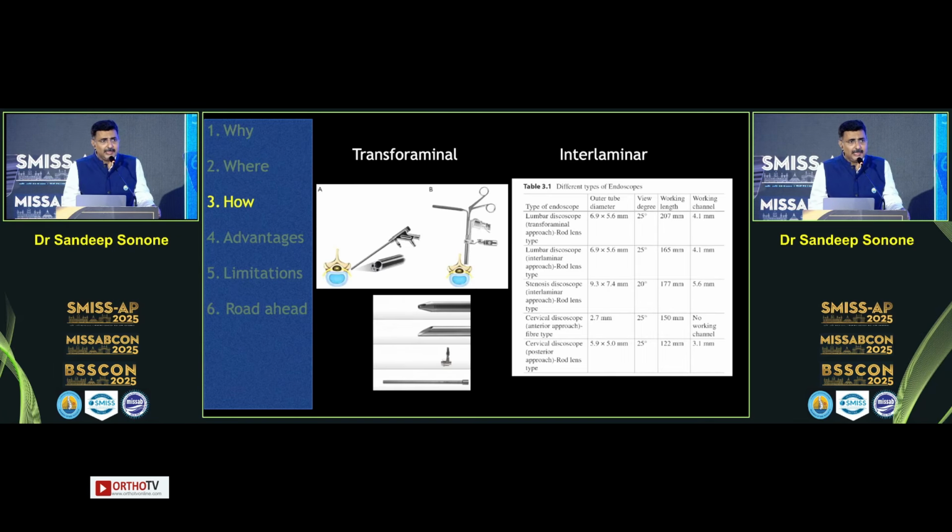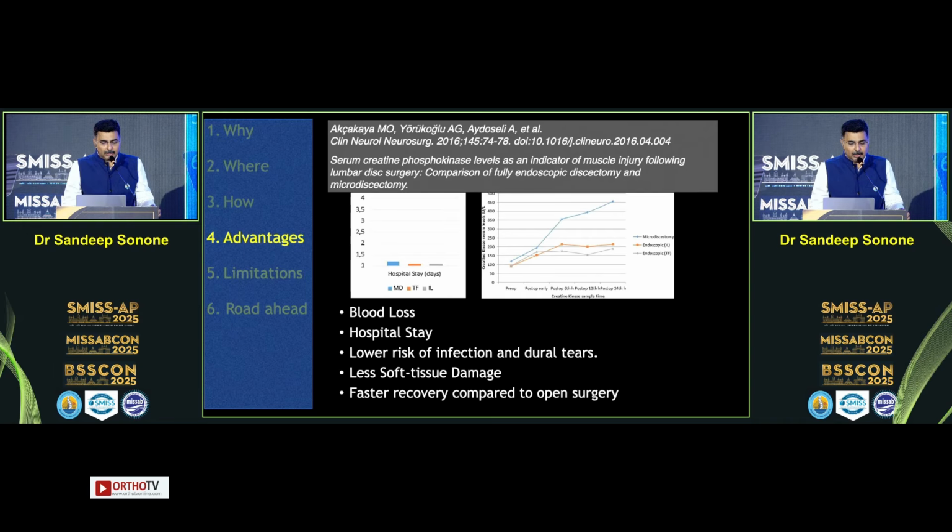Advantages are obviously that the endoscopic approach is less invasive, with less blood loss. It has a longer learning curve. As was mentioned by Dr. Bhupesh, there is a lot of inventory available, and you really have to decide what you want to use. There is a definite functional recovery as far as short-term results are concerned.